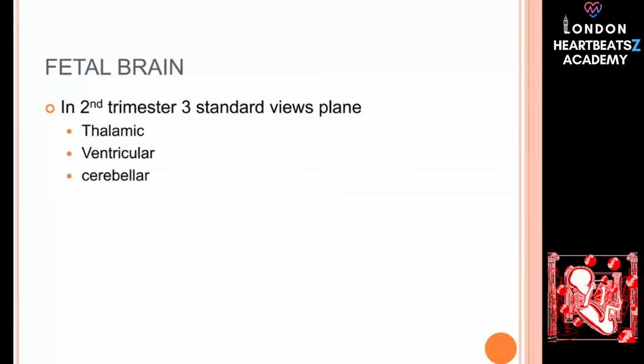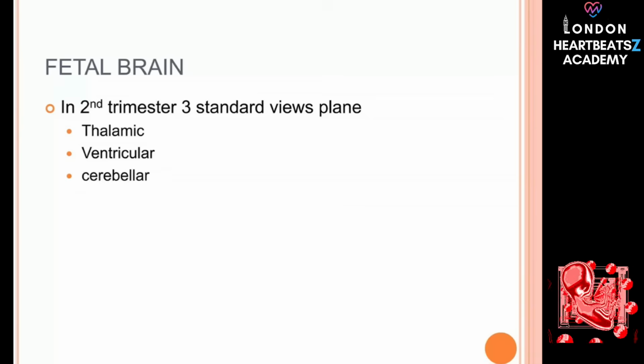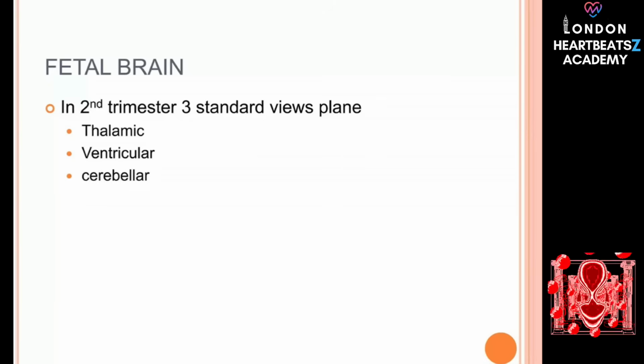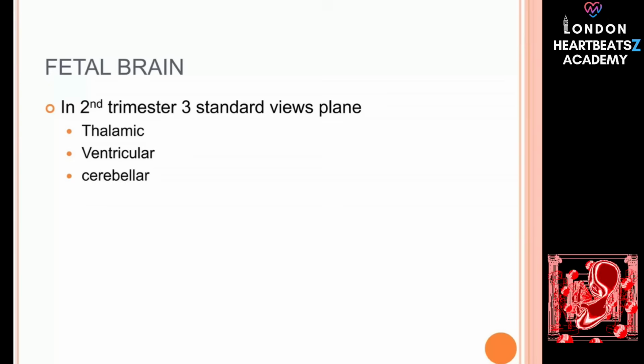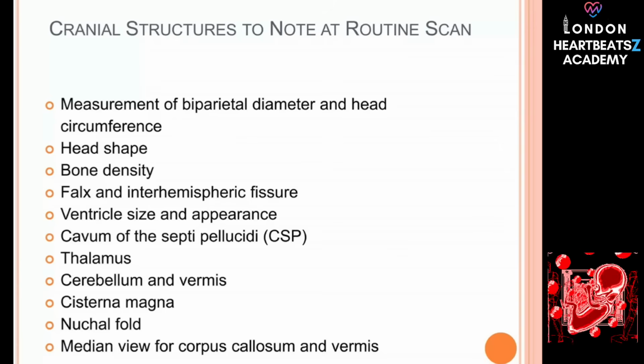To make sure every critical structure is evaluated consistently and accurately, sonographers follow a very specific systematic protocol. This isn't just about looking around randomly. It's about using standardized views and sweeping through the anatomy in a specific predetermined order. For areas as complex as the head and face, having a systematic approach, whether it's that specific rule of three method or another protocol, ensures thoroughness and, crucially, reduces the chance of missing subtle or even obvious findings.